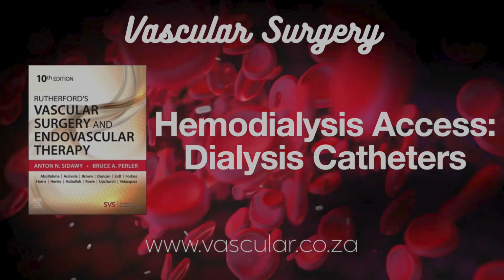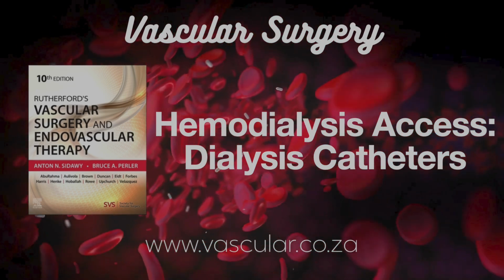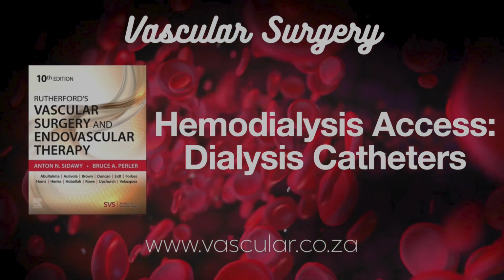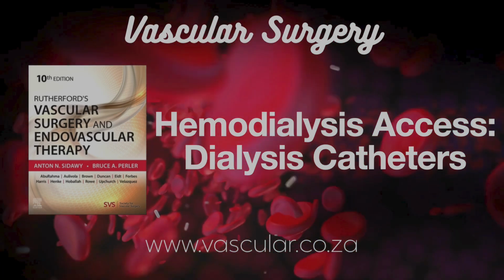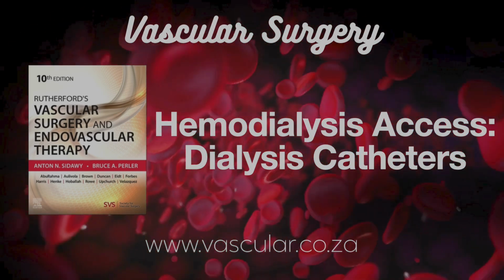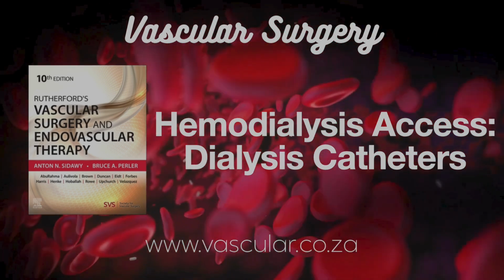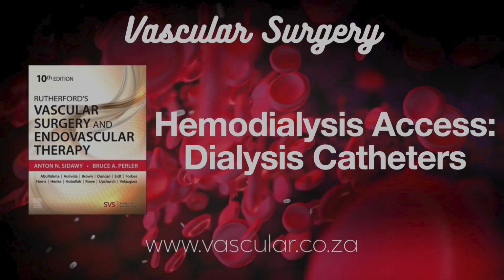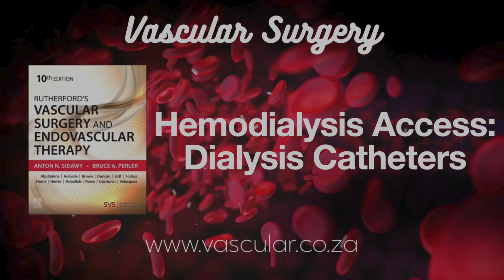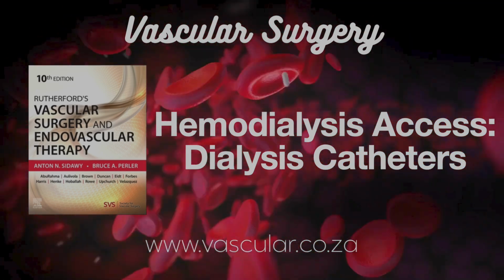Several reasons. One, many patients already have some underlying vein issues, blockages, or narrowings that make just blindly sticking a wire in dangerous. Fluoroscopy lets us see the wire's path. Two, we use stiff dilators and sheaths to make the track for the catheter. Under fluoro, we can see if the wire is kinking or if we're pushing too hard against the vein wall, which could cause damage. Prevent injuries. Exactly. And finally, at the end, we use it to confirm the catheter tip is perfectly positioned, usually in the right atrium, and that there are no kinks in the catheter itself.